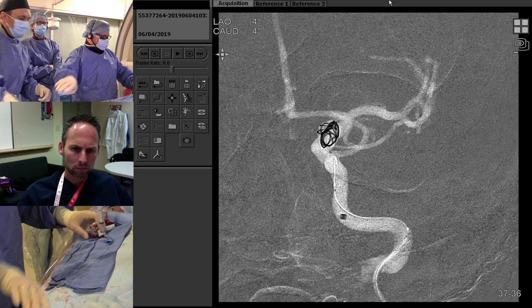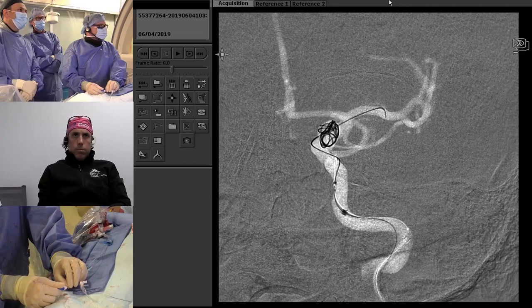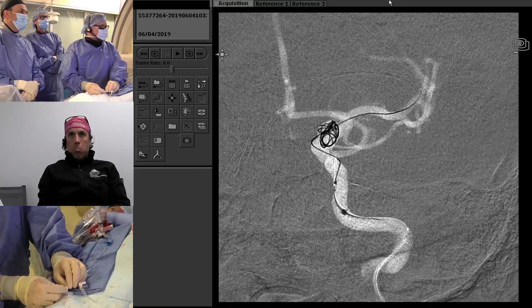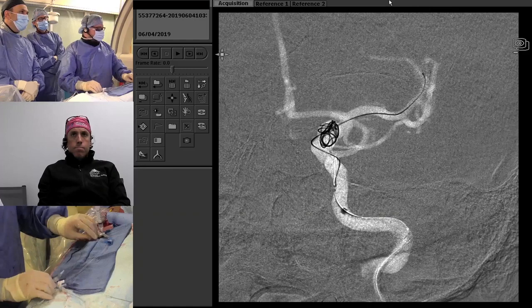You can see we just navigated past the coil mass. This is obviously the most concerning part here because what I don't want to do is dislodge the coils — which is partly why I tend to prefer to jail the microcatheter, but it is what it is at this point.